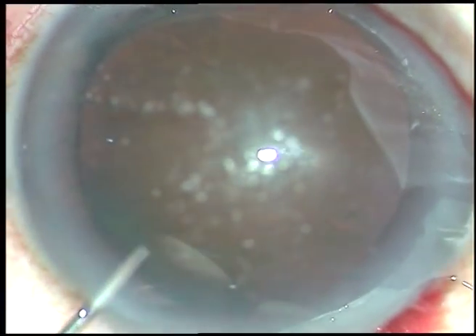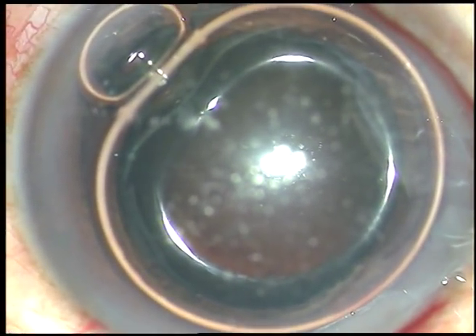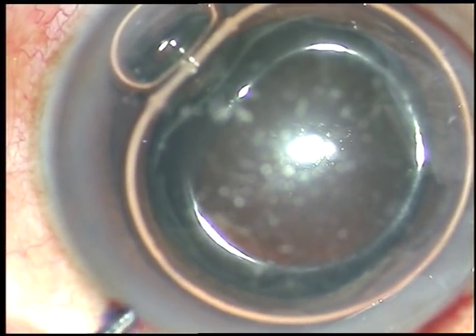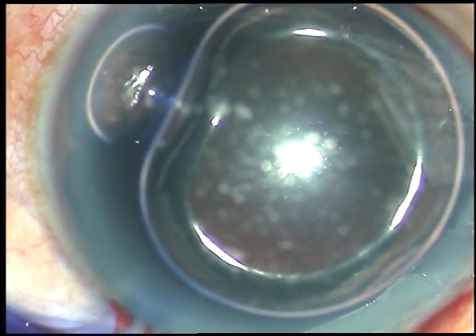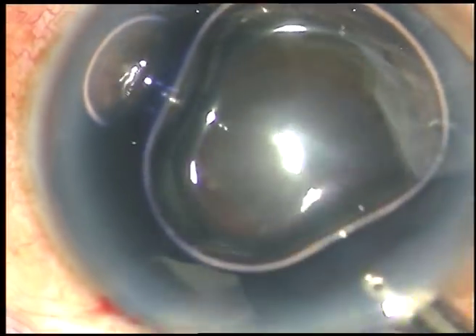And now, I want to stain the anterior capsule of the cataract because the contrast was not good. And here goes the dry trypan blue dye. If you stain the anterior capsule underneath the air bubble, the staining is very nice and very quick.